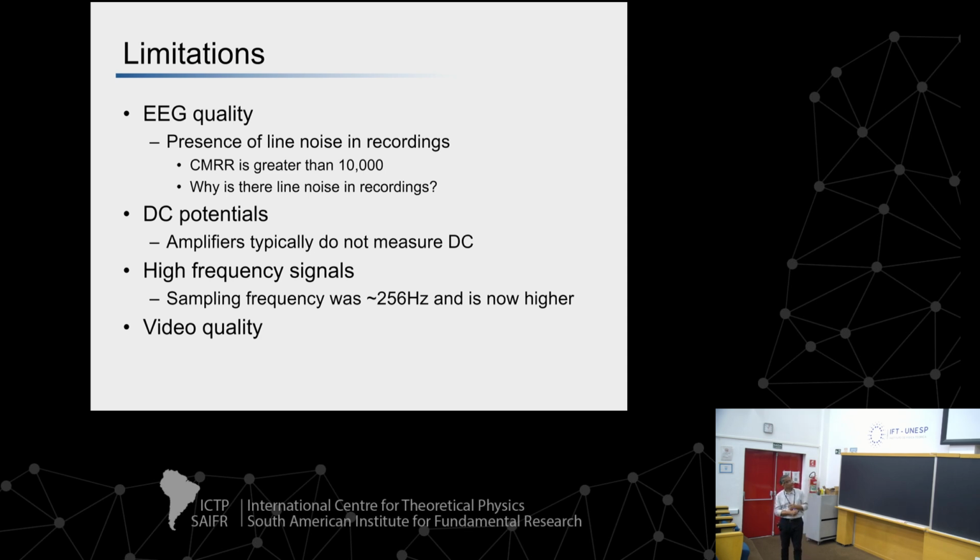The amplifiers typically do not measure DC, so that's valuable information that we're not capturing. And the frequency, we used to sample at roughly 256 hertz for many years, but more recently it's higher.